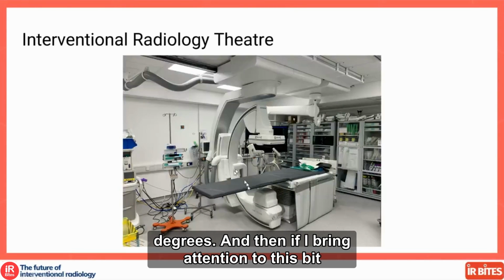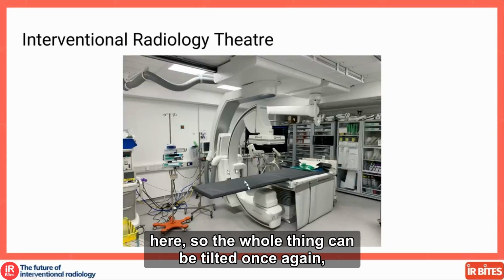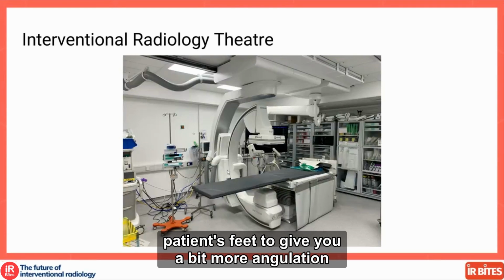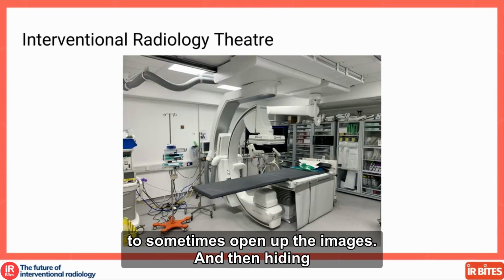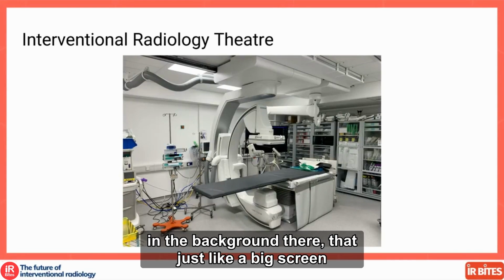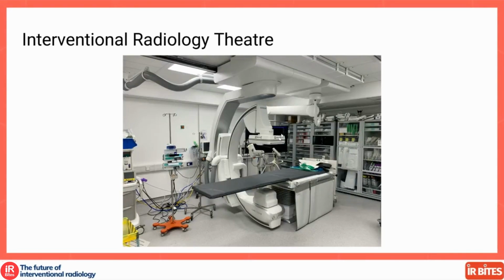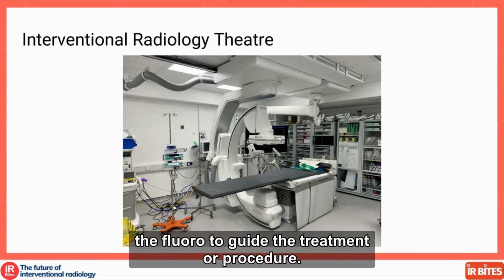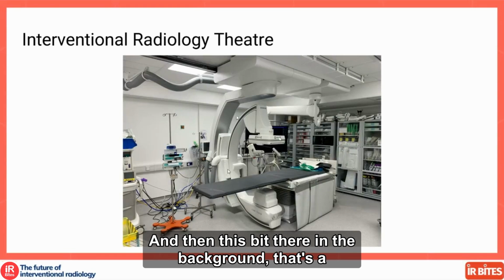If I bring attention to this bit here, the whole thing can be tilted once again, either towards the patient's head or towards the patient's feet, to give you a bit more angulation, sometimes to open up the images. And hiding in the background there is a big screen that shows the live pictures of the X-rays and fluoro to guide the treatment or procedure.